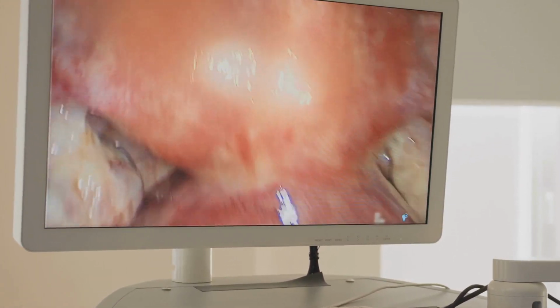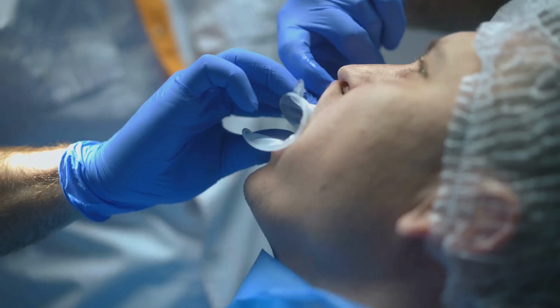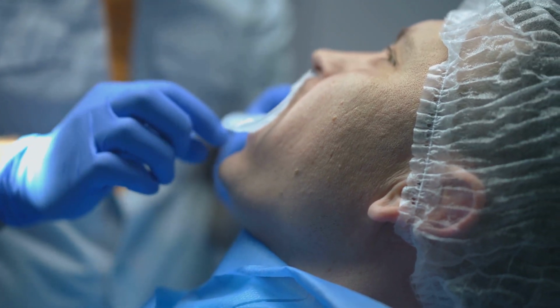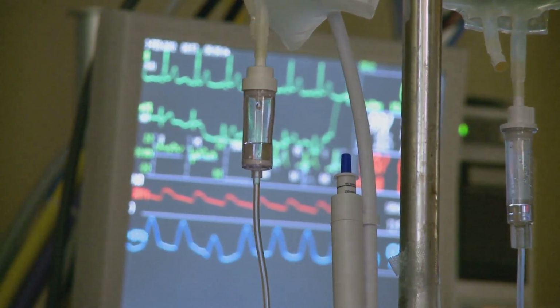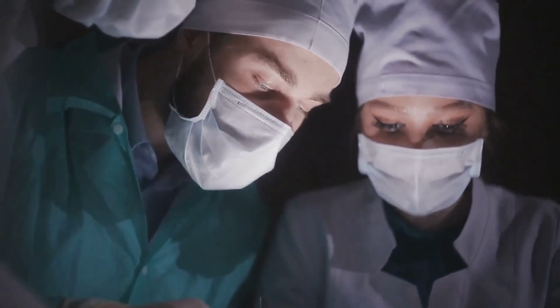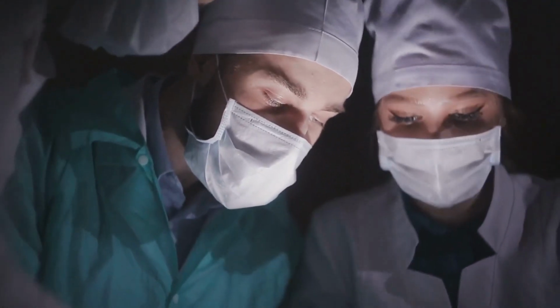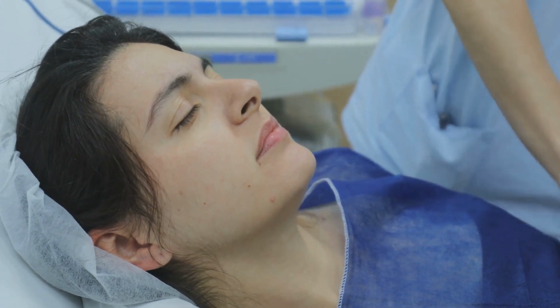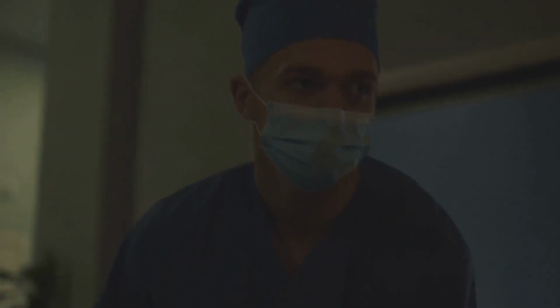The first step in the intubation process itself is to insert the bronchoscope. This is done through the mouth or nose, depending on the patient's condition and comfort. Advance it gently, keeping an eye on the monitor to guide your path. You're aiming for the vocal cords, the gateway to the trachea. Once you've reached the vocal cords, pause for a moment. This is a critical juncture. You want to make sure the patient is comfortable and not coughing or gagging. If they are, pause, reassure them, and allow them a moment to adjust.